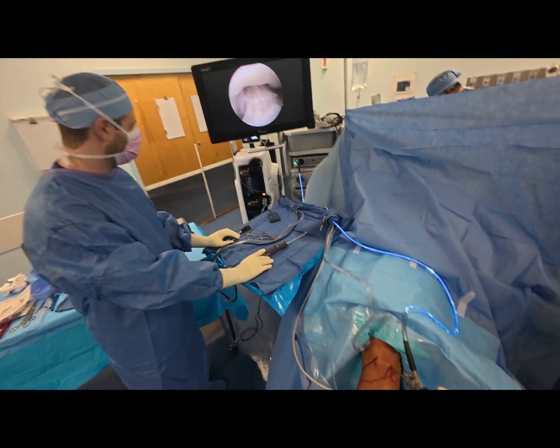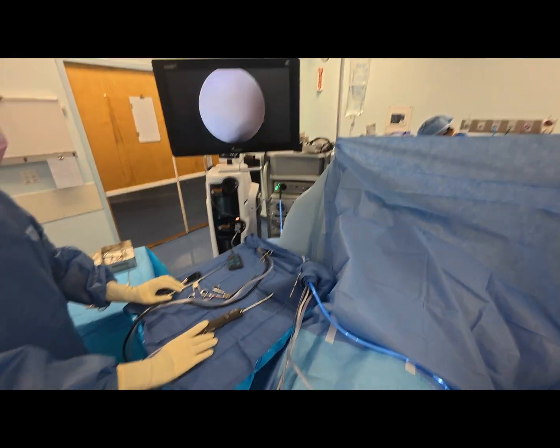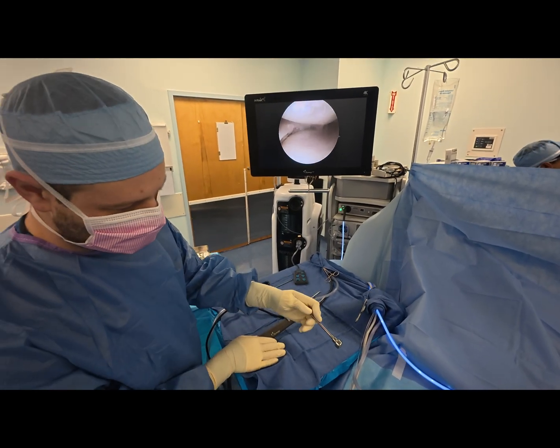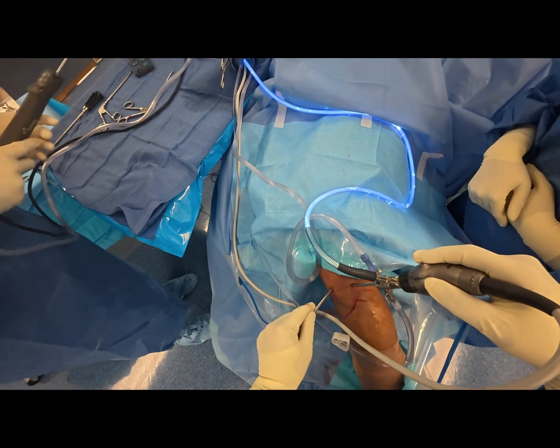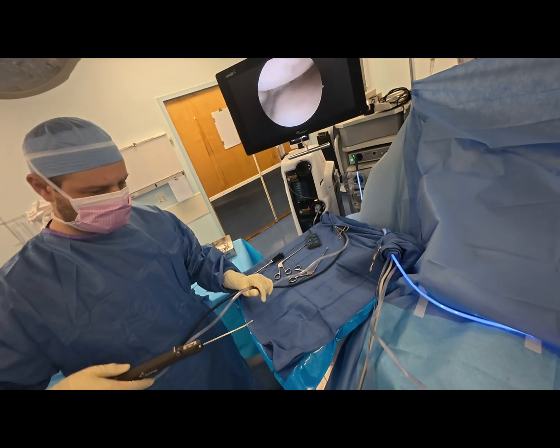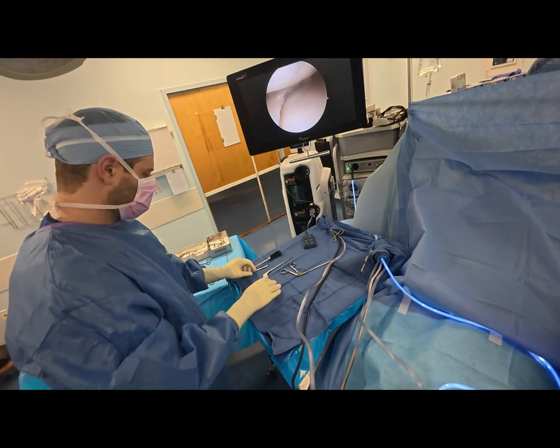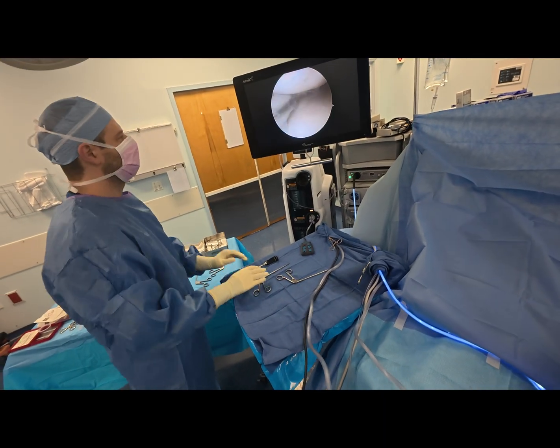Hopefully by now we're good. I'm going back into the medial compartment. Okay, should be good? All right, short blunt. Yeah, so you can see it opened up right now. So it should be relatively easy for me to address this pathology.